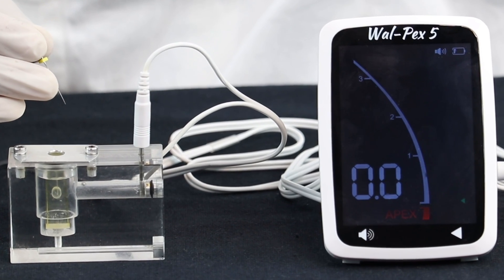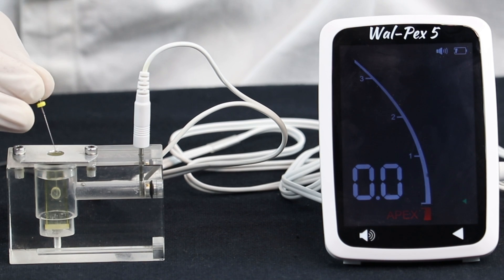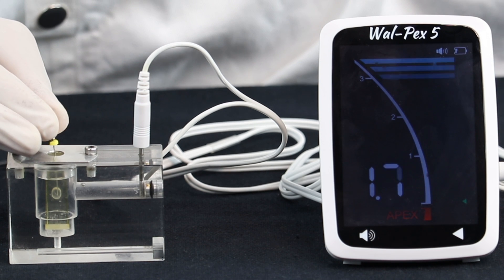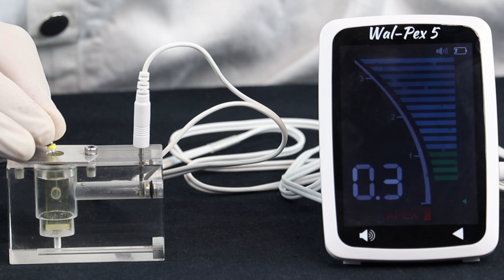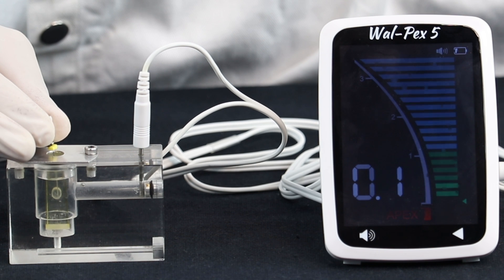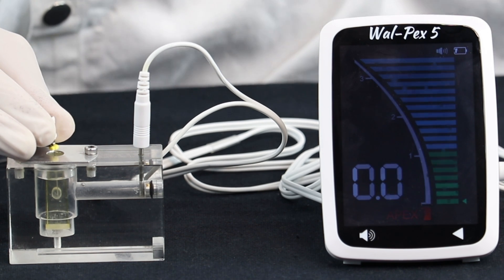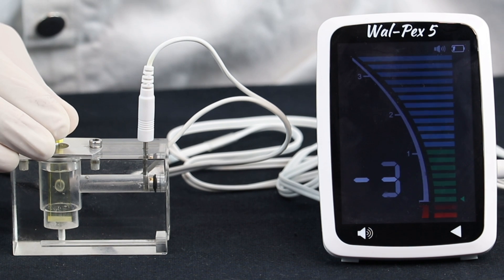We will see how VOLPEX 5 works on this acrylic simulator. We will introduce the file slowly into the canal using a watch-winding motion, and you can see the progression of the file on the screen. As the file reaches the position of the apical foramen, the reading is displayed as 0. The strips are green in the apical area, and as we go beyond the apex, it becomes red with a faster beep.